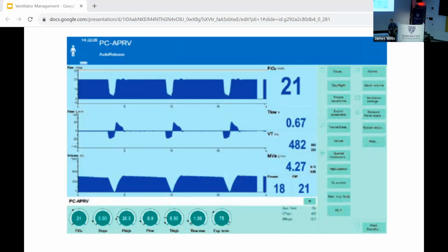So the question is how soon after plateau pressure? You can check it pretty soon. You may want to give the system a little bit of time to equilibrate. So when you change, let's say, a tidal volume from 450 to 420, maybe give it a little time to equilibrate, and then you could check it. There's no hard, fast rule, and then you can do an inspiratory hold.